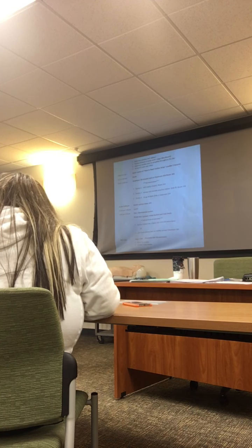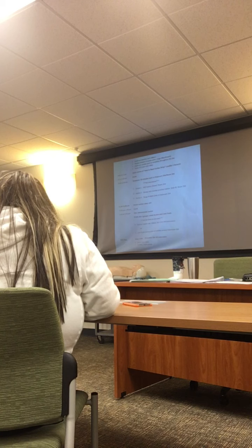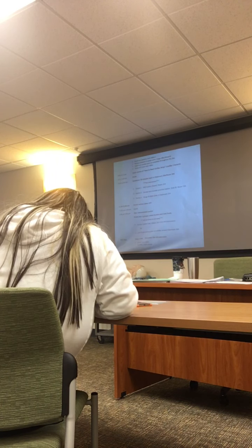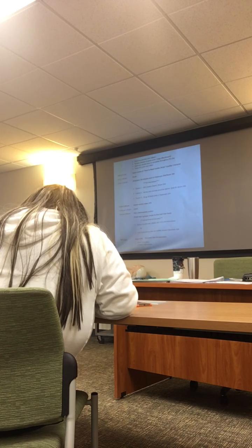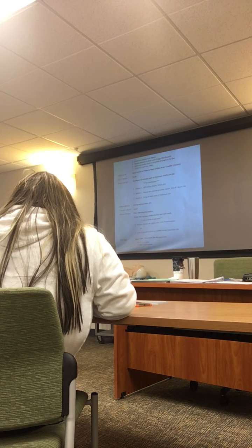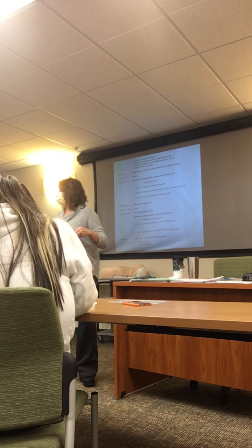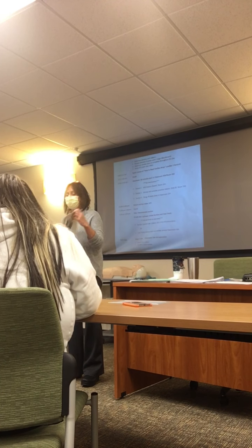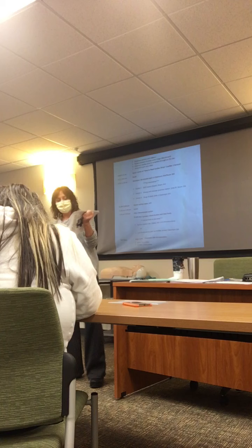But you guys will get to see this, and a lot of you guys are in Jess Curry's group, right? So on 5, you're in 4D, but do you still have some people on monitors at the bedside? Sometimes. Okay. So you will see this then if you go to a different setting like cardiology, we're allowed to go there now, or ICU or ER. So you can pass that around just to see how little the markings are. So you really have to look very closely. That's why we use these calipers.